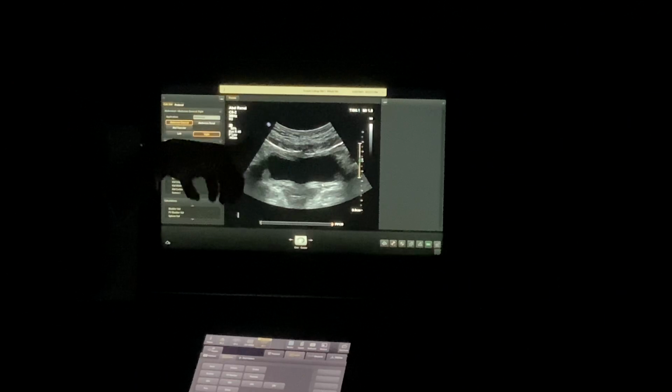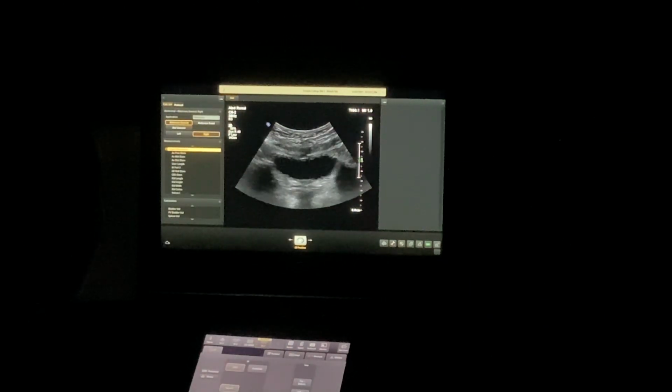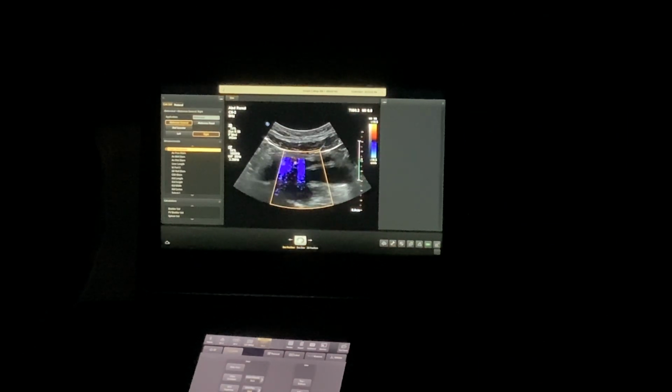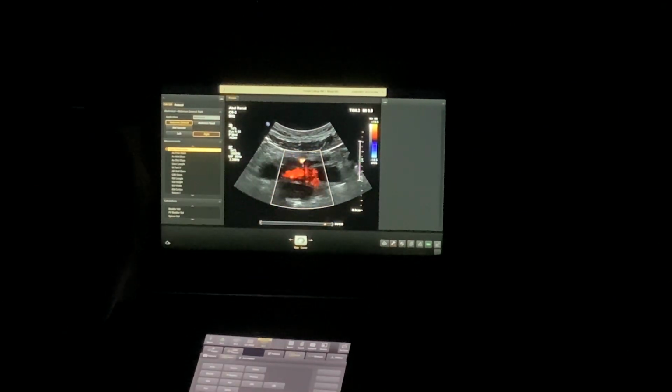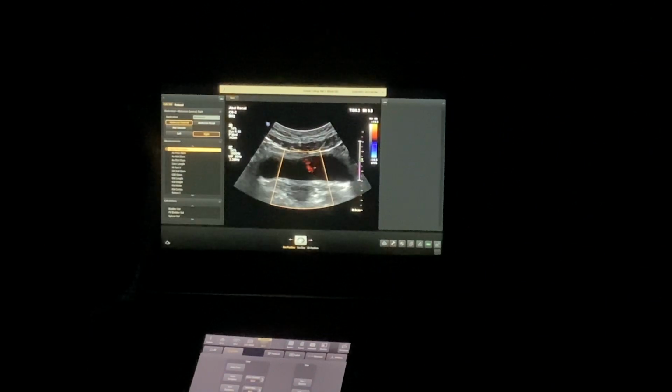So that approach is going to give you the best angle to see your jets. If I'm angled all the way down here, I'm probably not going to see them. If I'm angled all the way up like that, less likely so. Okay, I saw that one. Now your bladder's filling back up. So if the color is coming from here down, there's your other one.